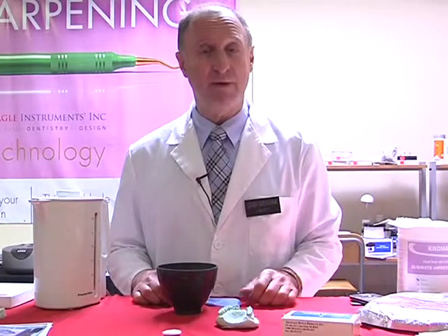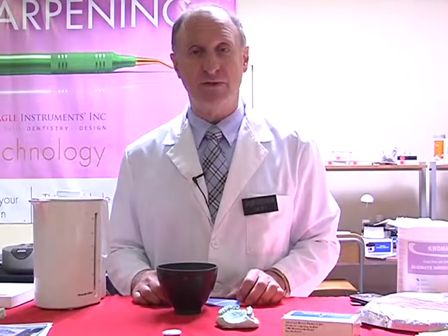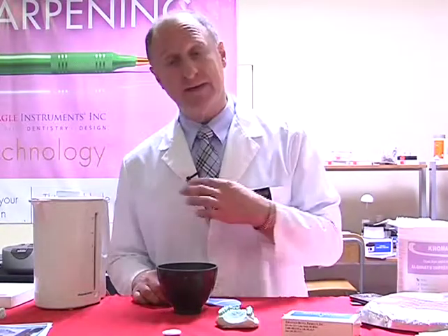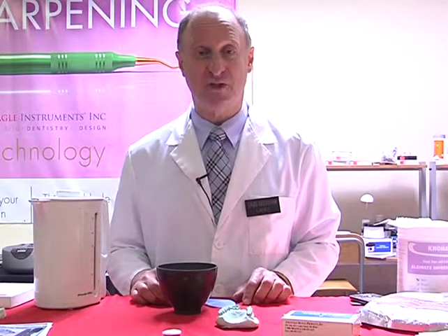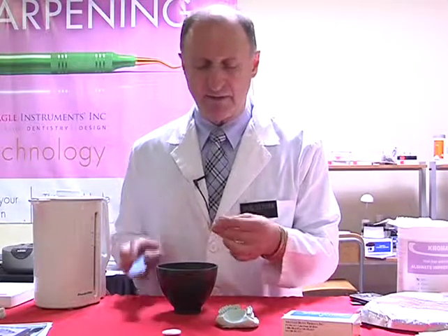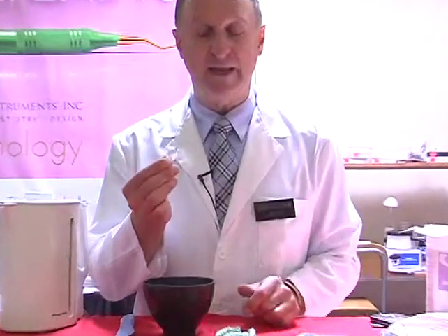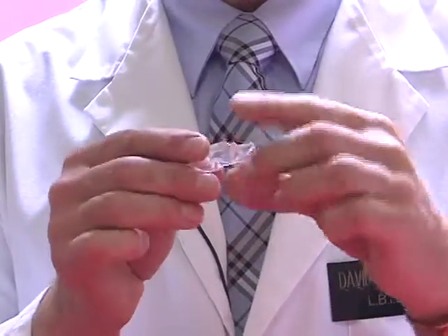And in the microwave, take a regular ceramic cup, fill it 3/4, half full water, put it into the microwave for 2 minutes, be fine. The water itself should be sufficiently warm. Once the material itself is ready to go, it will form itself and turn clear. So it's changed from being white to its clarity, clear.